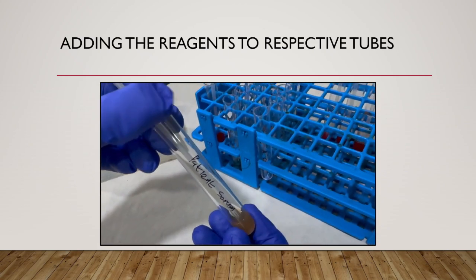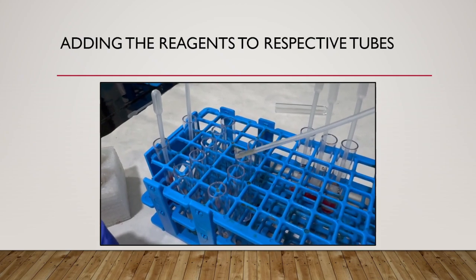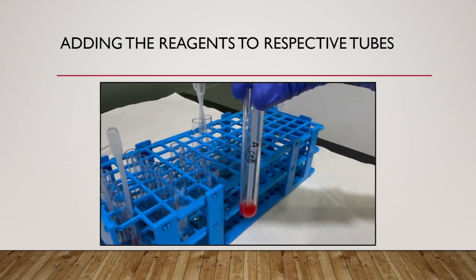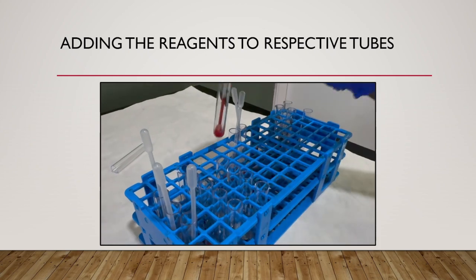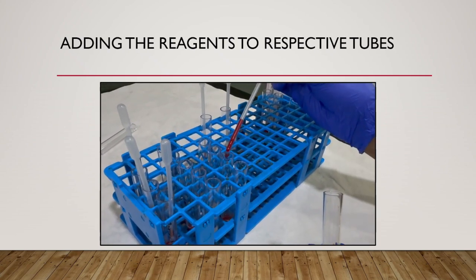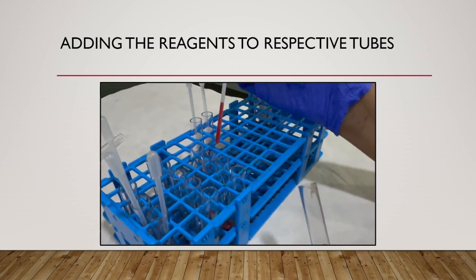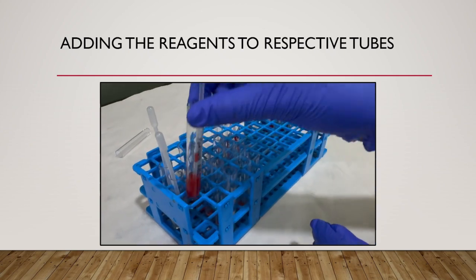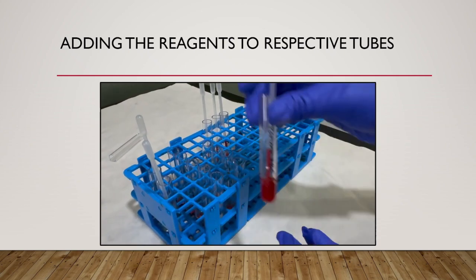Now coming to reverse grouping, this is the patient serum. We are adding 1 drop each of patient serum to the A cell, B cell, O cell and auto control tubes. This is the pooled A cell at 3 to 5% concentration. We are adding 1 drop of pooled A cell to the reverse grouping tube, 1 drop of pooled B cell to the corresponding tube, another drop of pooled O cell at 3% concentration to the corresponding tube, and in the auto control tube we are adding 1 drop of the patient's own RBC to detect if there are any cold or warm autoantibodies.